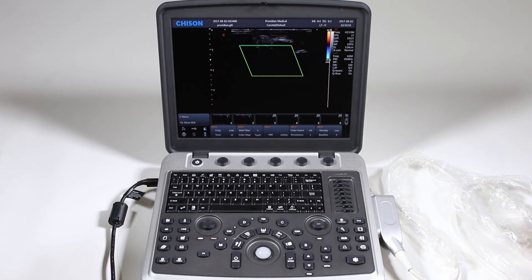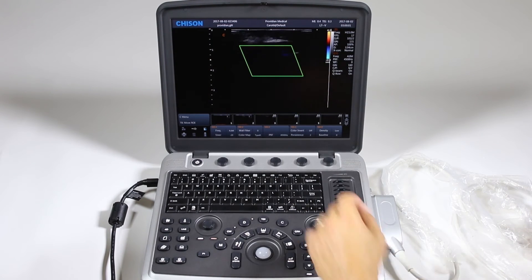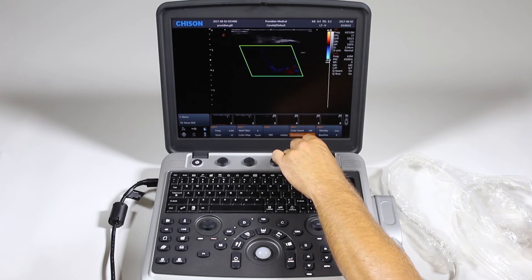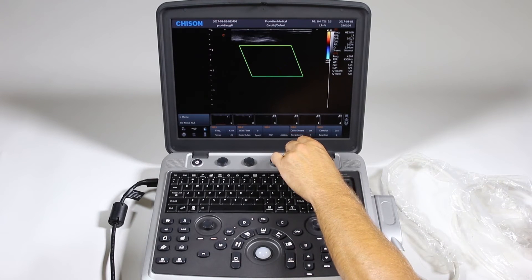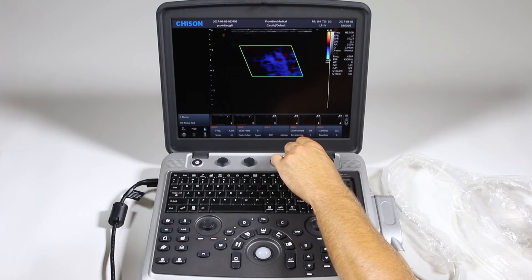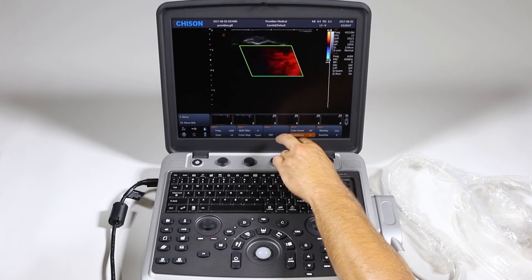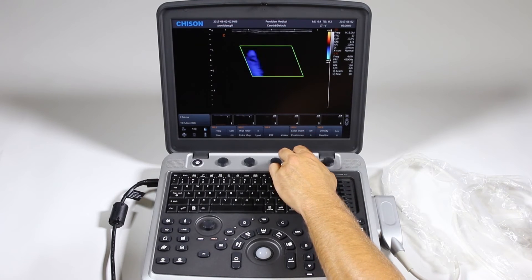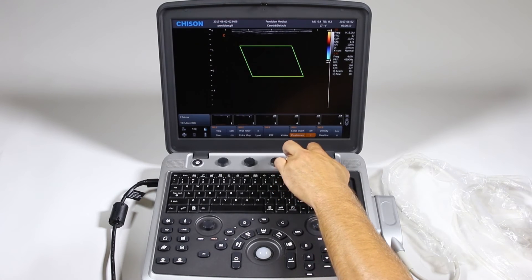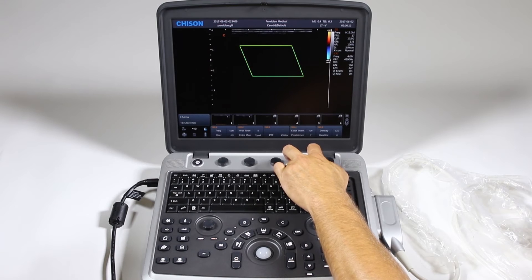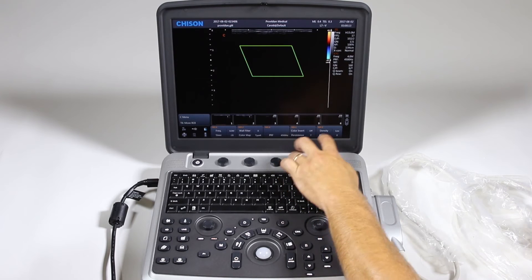Persistence will show you how long that color stays on. It'll make it flow or just flash. So the higher the persistence, the longer that color will stay on the screen. So if I turn it all the way off it just will flash through, whereas this way it stays on the screen for a long time.